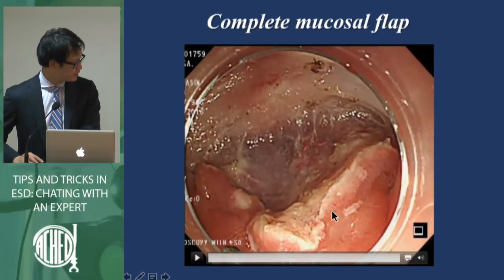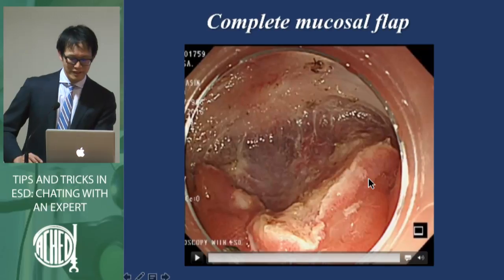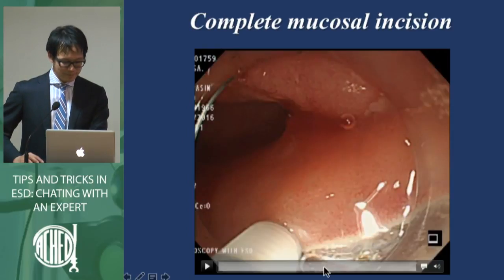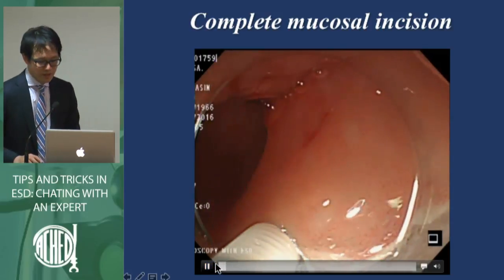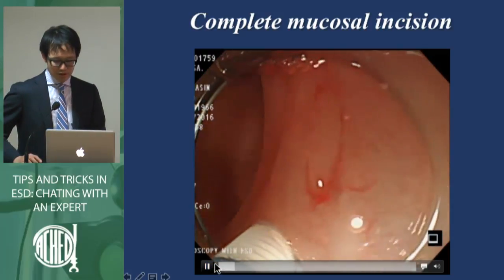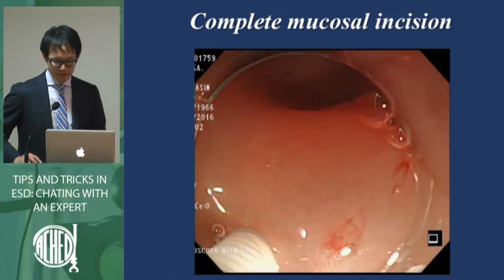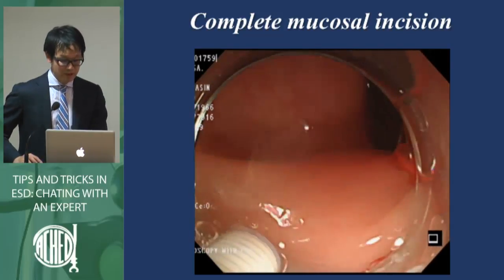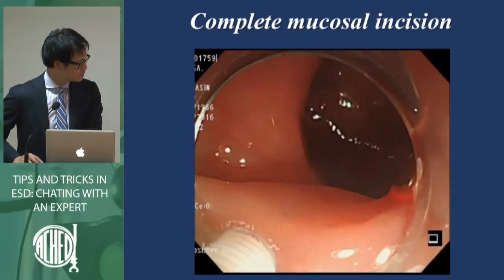If you create the mucosal flap, it's much easier to almost complete the ESD procedure. So I cut the mucosa over the lesion. I complete the circumferential mucosal incisions.